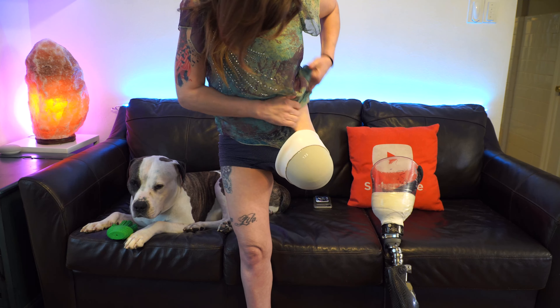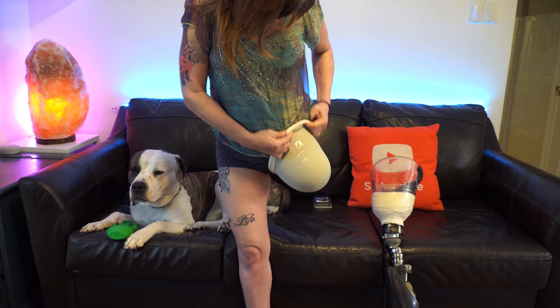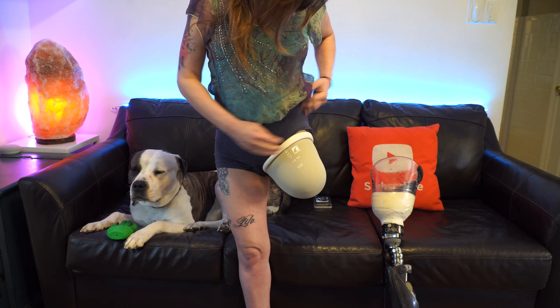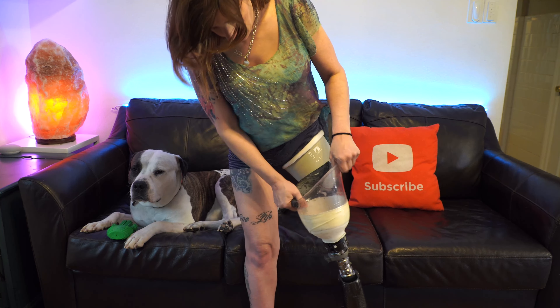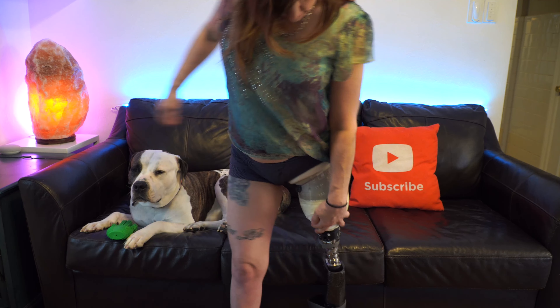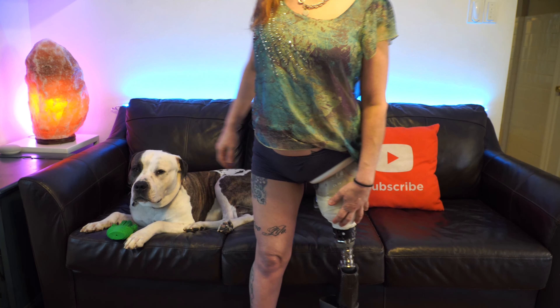Here's the little pad that my prosthetist added because the edge of the check socket was kind of digging into my groin and it was a little bit uncomfortable. This is the limb logic pump that sucks all of the air out of my check socket so that my leg stays in place. And then I have this type of liner — this is a different system than what I've had in the past, so this is how I put this system on my leg.